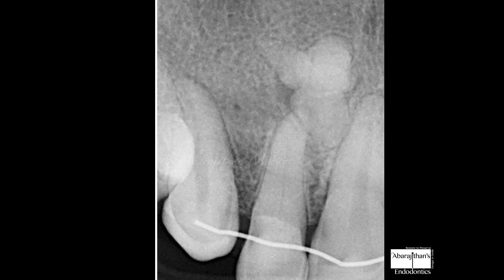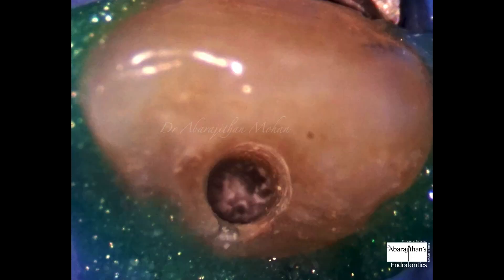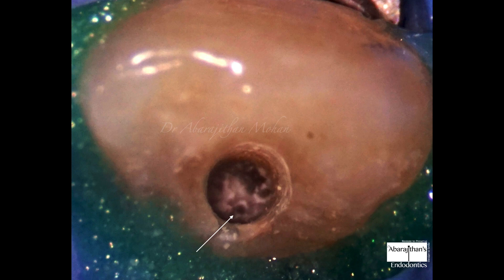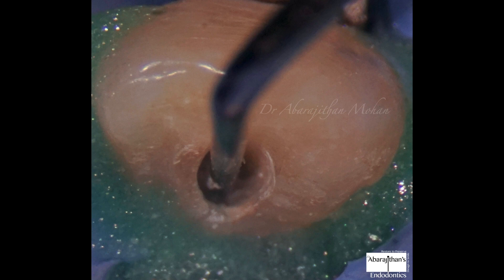So now we are going to start endodontic treatment in tooth 12. Pre-operatively, we need to know in what direction and to what depth I need to penetrate with my drills to reach the patent canal. We start with the conventional access — magnification plays a very important role here, and the color change is also very critical. We also need to search for purchase points. In these cases you need to be careful because you need to drill a little deeper after the conventional access to reach the cervical or middle third of the root.